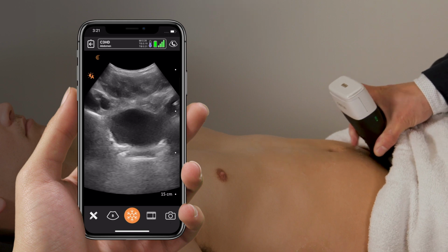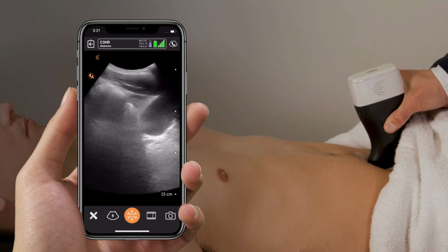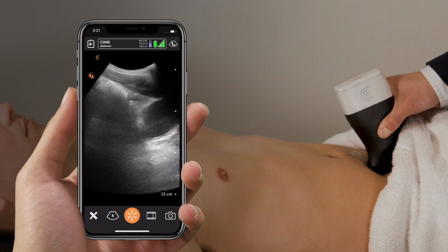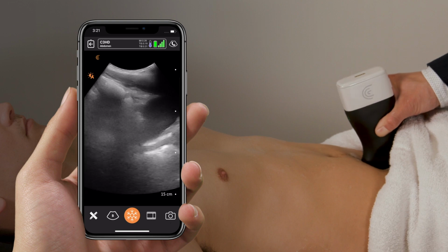And here it's also helpful to rotate the probe 90 degrees into a sagittal position. And from here, again, we see our bladder, which is our landmark, and we're going to sweep our probe side to side to look for fluid superior to the bladder.